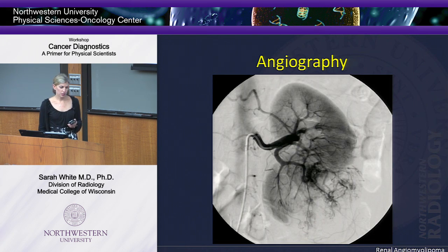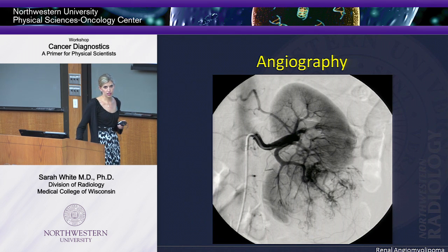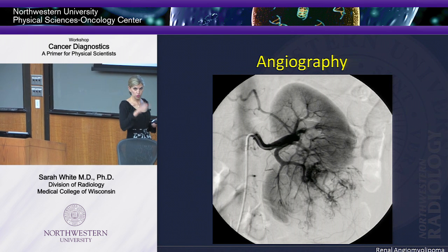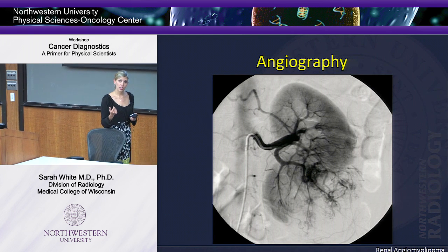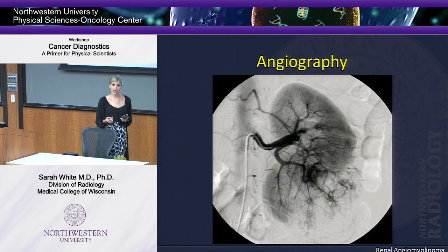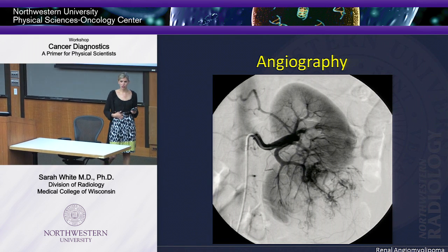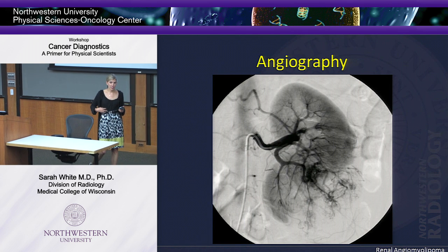Now, angiography, there was a very smart man, Chuck Mistretta, who decided that angiography is basically doing real-time X-ray. So my pedal, the X-ray is coming continuously, and I'm injecting contrast. So contrast is something like barium. I can see it. The problem is when you inject contrast, you have bones in the way, especially if I'm going to be looking at organs in the mid-region, so your kidneys, your liver.